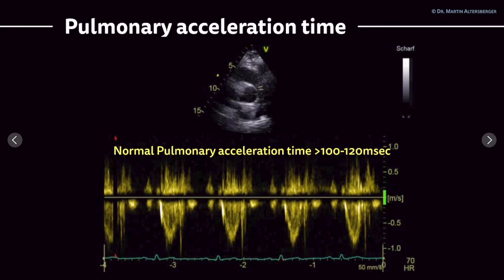We can measure, for example, the pulmonary acceleration time. The pulmonary acceleration time is this time interval here — this is where right ventricular systole starts, and until you reach the peak, a certain time interval passes, and that's the pulmonary acceleration time. Depending on age, the normal value is above 100 to 120 milliseconds. This would be a normal example of a pulmonary acceleration time.